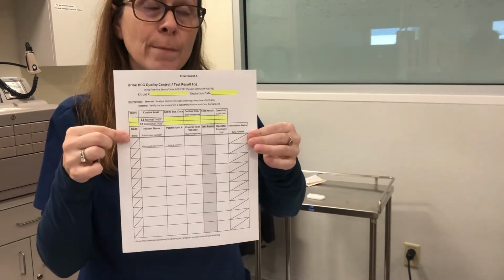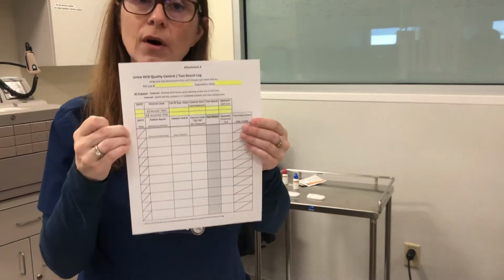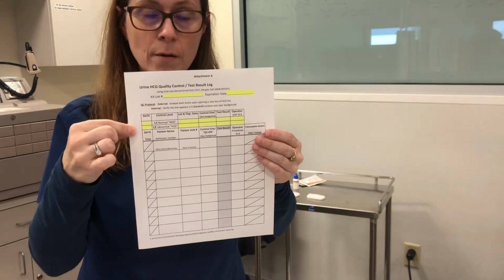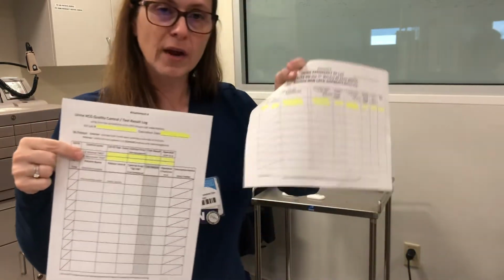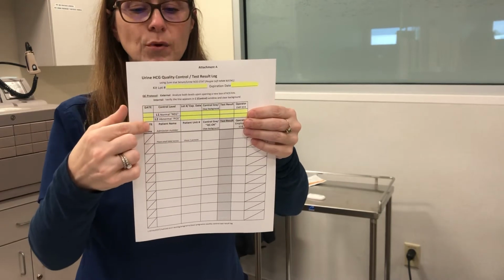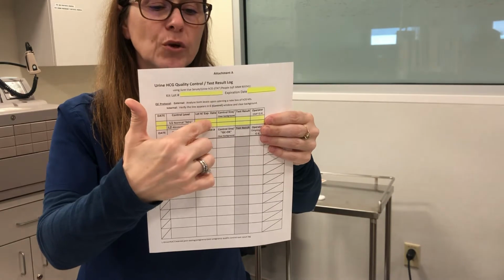If Point of Care comes out here to audit us, or if Joint Commission were to audit us, and this information was left blank at the top of the form, this would be invalid and we would be cited for this. So whatever data that you just ran, it has to be transferred here. So your date performed, level 1, level 2, your lot number and expiration date.